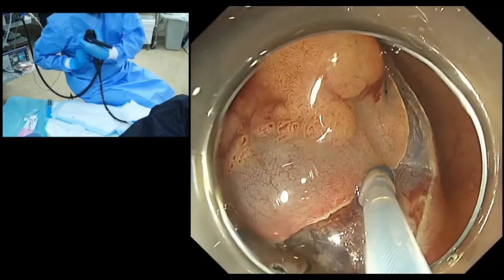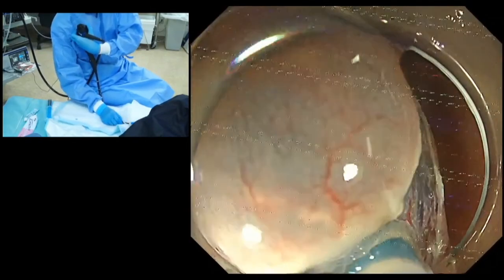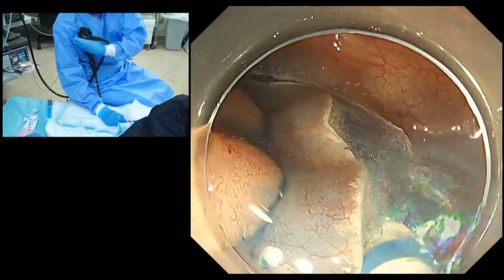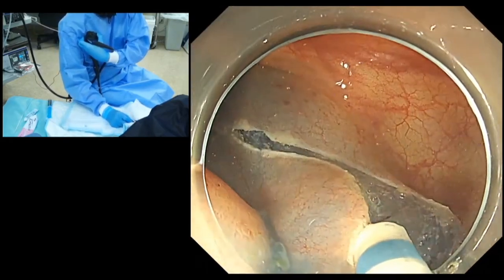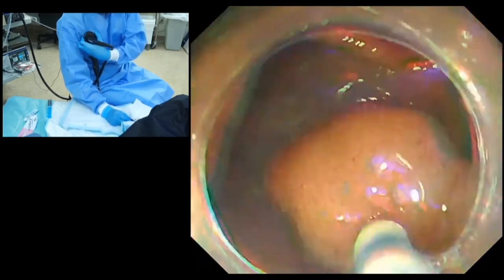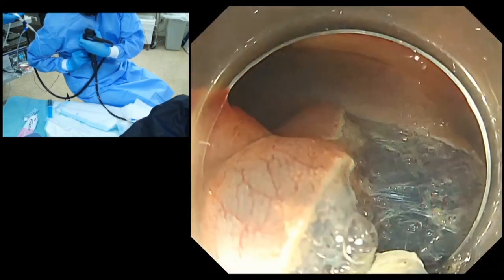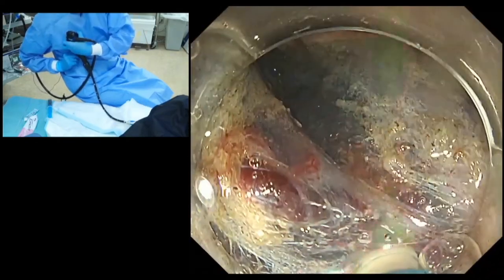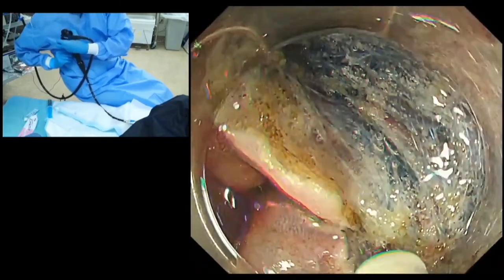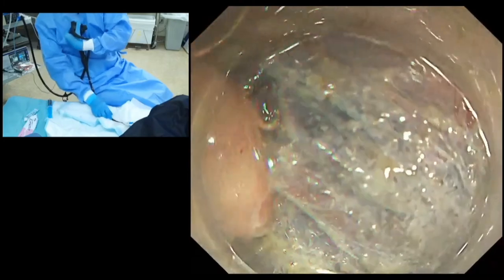Carefully catching the edge of the mucosal incision from the upper side, I'm continuing the mucosal incision to the lower side. As long as the white ceramic tip is staying on the surface, it is quite safe to do the mucosal incision. This is the end of the circumferential mucosal incision. Right after circumferential mucosal incision, I gave an additional fluid cushion through the knife. The target tissue was nicely lifted up, and I quickly started submucosal dissection using swift coag. Just tracing the inner edge of the incised area, I can easily open the submucosal space. There was a rich vascular network within the submucosal layer, so I dissected the submucosal tissue very carefully.